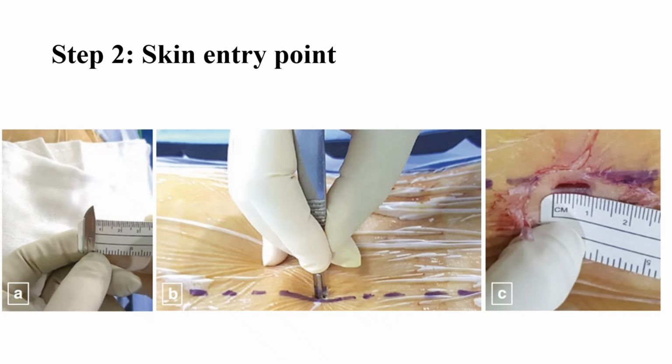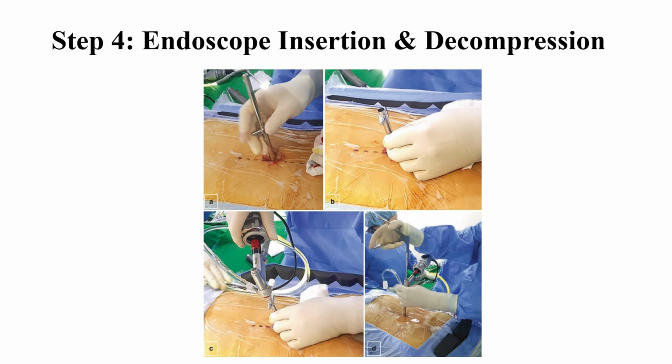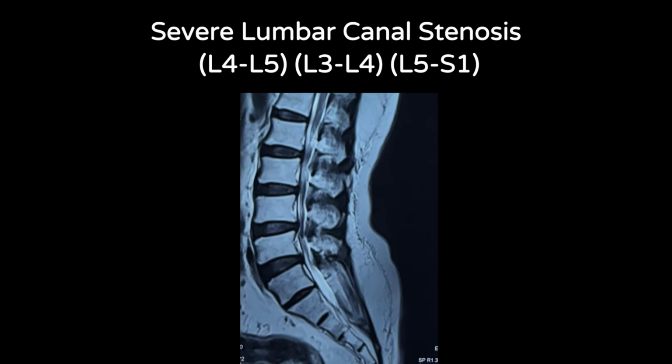Typically, this incision remains around 9 millimeter, as your scope is 8.4 millimeter and the working sleeve is 9 millimeter. So it typically remains 9 millimeter or 9.1 millimeter maybe. So after dilation, put your obturator inside, put the working sleeve inside, remove the dilator and put your scope inside. Once you put your scope, then you will be having such kind of view.